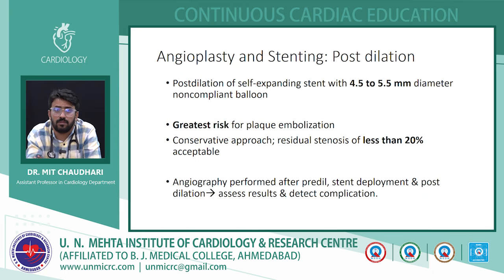During this particular step, there is the greatest risk of plaque embolization. Another risk is during the dilatation of the lesion, putting in a stent, or doing a post dilatation. The carotid artery has the carotid body and carotid receptors that can get activated, producing a vagal response, and the patient can undergo severe bradycardia and hypotension. So you have to be prepared for that during the procedure.